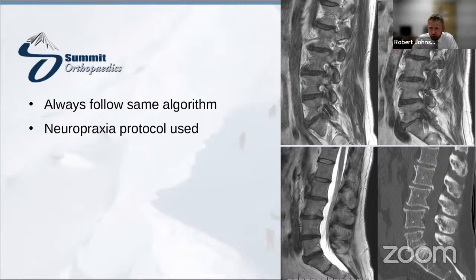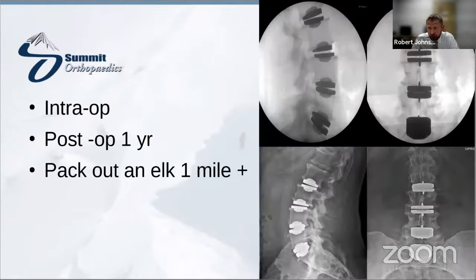So as you can see on the MRI, there's quite a bit of foraminal stenosis at L5-S1, associated with those bone spurs, a little bit at L4-5, not so much as you get up, but most of his symptoms were in that L5-S1 region and the foramen. This left-sided picture over here on the upper portion is the left side, and then the right side is also the right leg. And so then he chose to do a 4-level disc replacement. So we did a 4-level disc replacement on him.